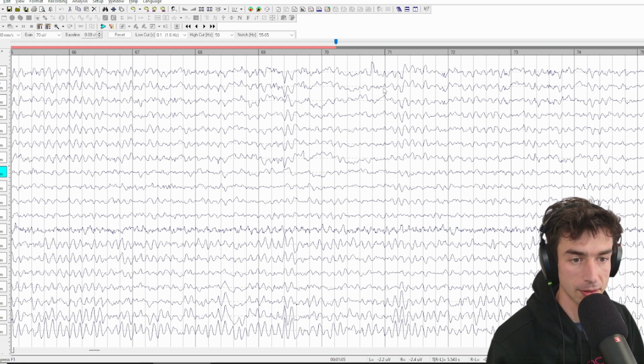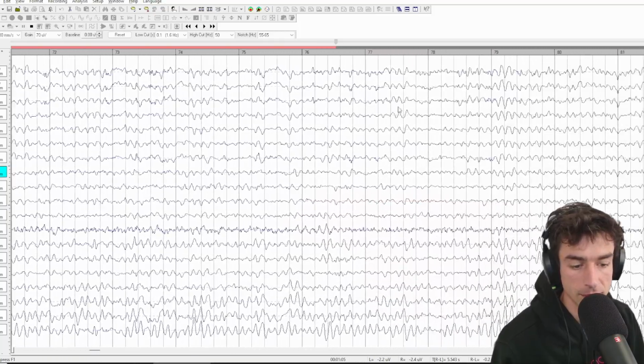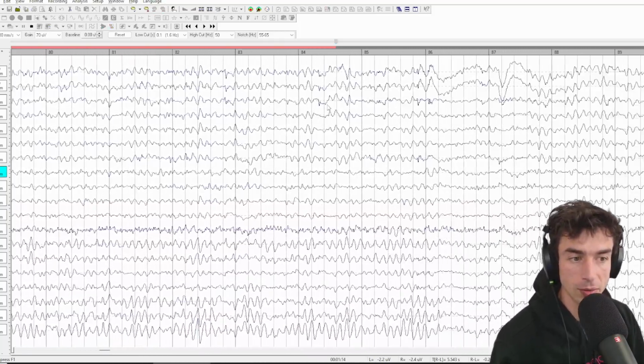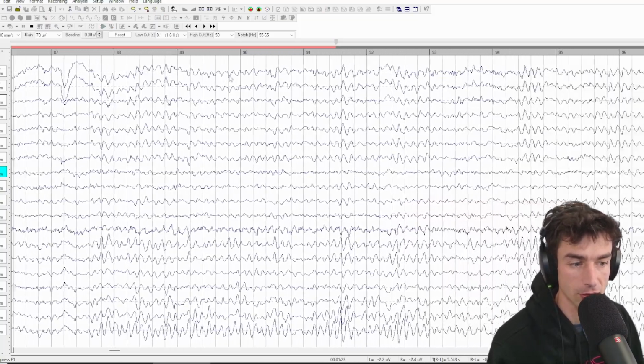Right now we're seeing some appearances of higher amplitude alpha that through volume conduction looks a little bit sharper at the front of the head. And alpha's doing what it likes to do, which is to wax and wane. Eyelid flutter, kind of eye blink, even though their eyes are closed.